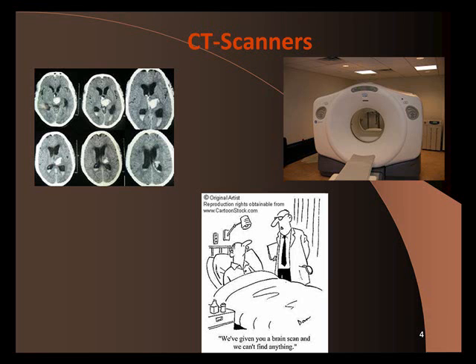Okay? And CT scanners, CT stands for, what does CT stand for? Computed tomography. Okay, so tomography comes from the Greek word cutting. Okay, so we're cutting through the patient. This is an example of we're cutting through the brain. So computed tomography. Okay.